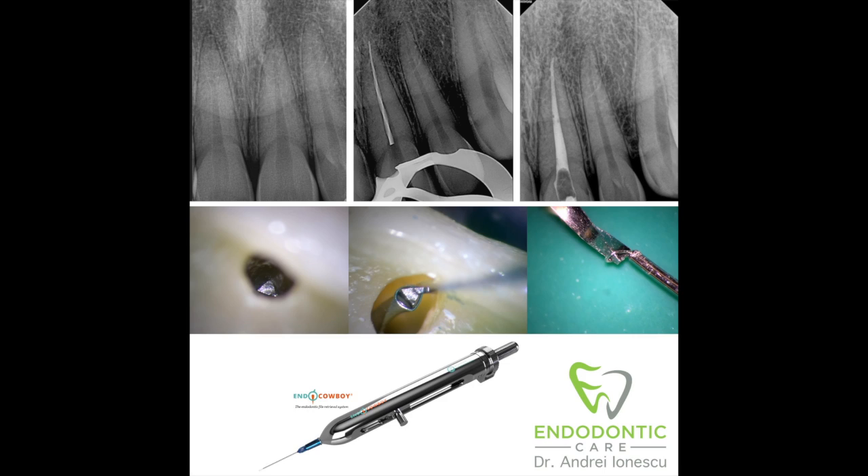Today I'm going to be sharing a case. This is the removal of a broken instrument from a central incisor using the EndoCowboy.